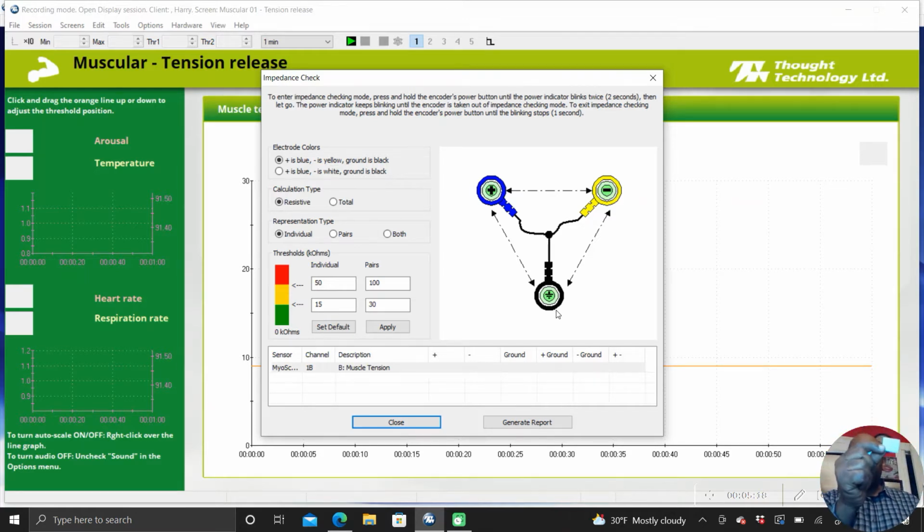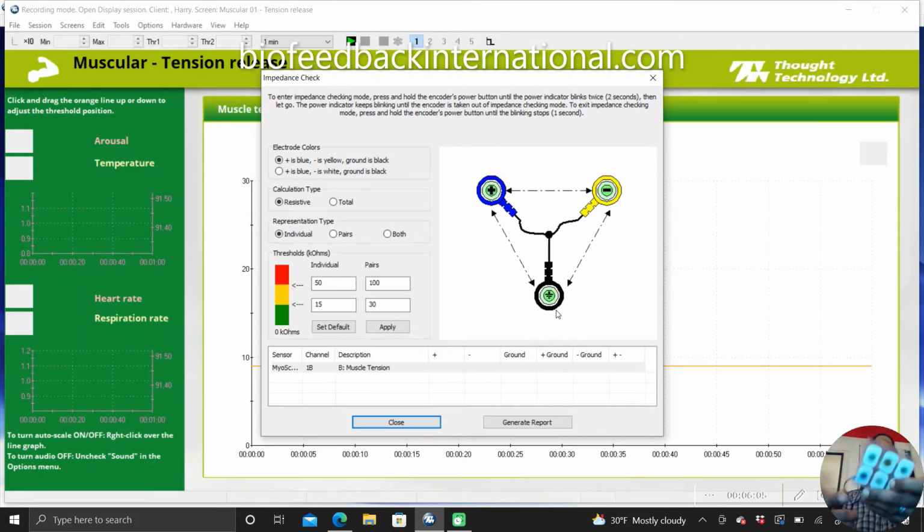So I'm going to take my alcohol prep pad and I'll just use my arm for this placement. Clean the skin. Let that dry for a while. While that's drying, I am going to snap these connectors onto the disposable electrodes. Okay, these are snapped on now. So now I'm going to just stick them on my arm. Arm should be dry now. Stick these on.